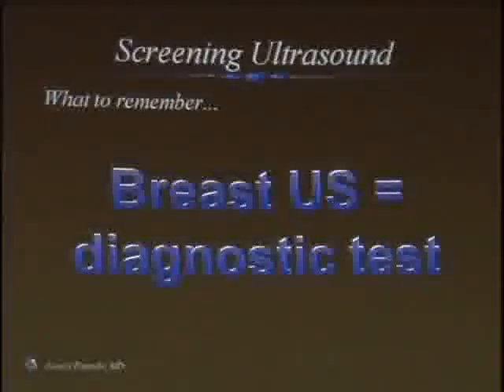I'll ask for your indulgence to ask at the end. Just write it down and we'll do it. Okay? Ultrasound is a diagnostic tool in the breast. If you remember that, you're in great shape.